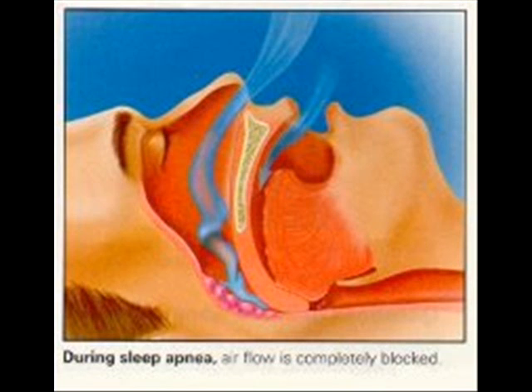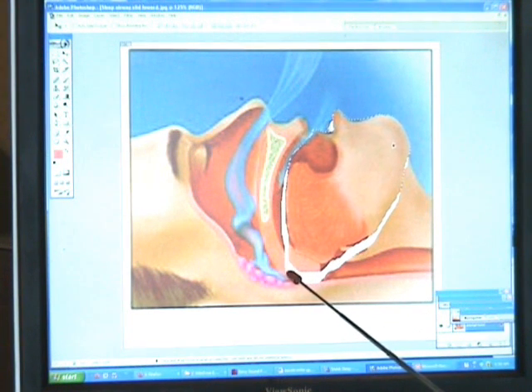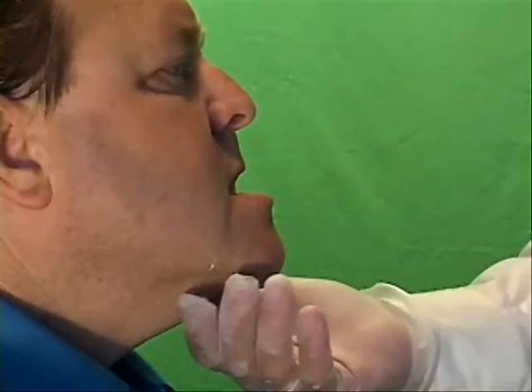There's no breathing done, and that's when you go through apnea. So what we do with the jaw advancement, we try and pull it forward, and it opens that airway really nicely and lets the air in. That's why we pull it forward. So we practice with the patient, and here he is going forward, practicing a couple of times so he knows exactly what you want to do when you get ready to take your bite plate.